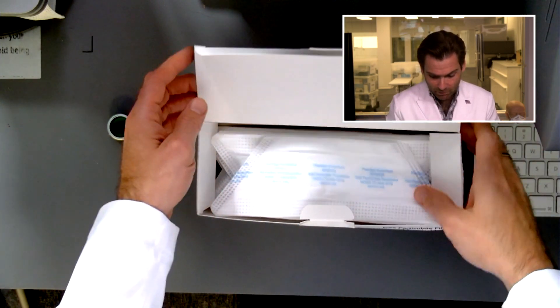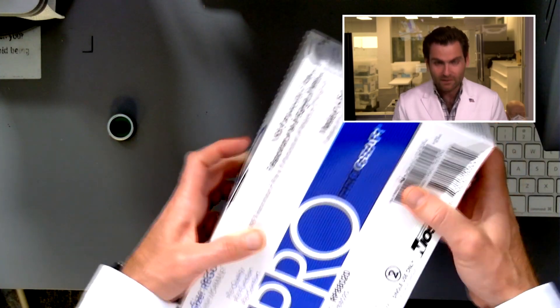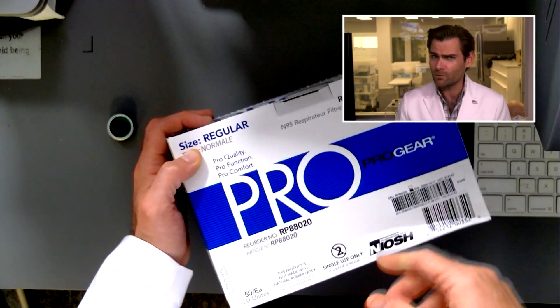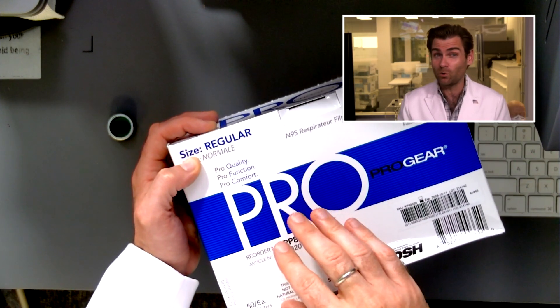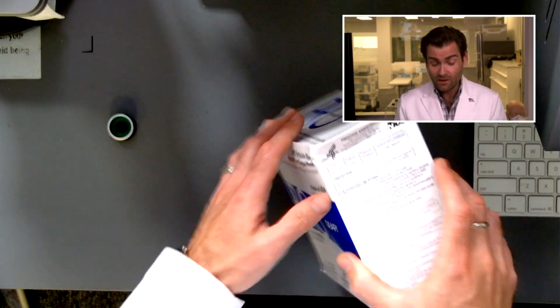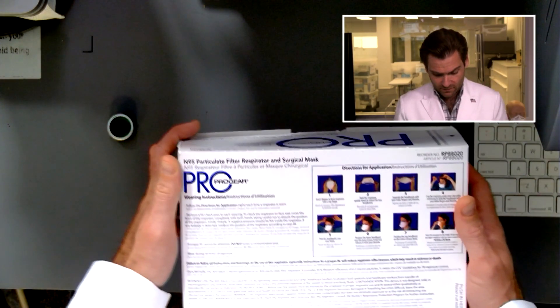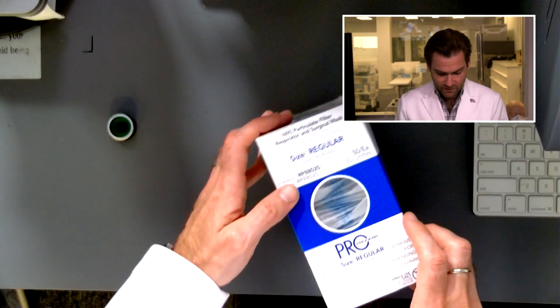I actually love the style of this type of mask in application, and I'll show you in just a second. But first, I want to show you this box — it's got a couple of cool features. It's not a soft-touch box but it does feel very professional. Prestige Ameritech is one of the oldest independent N95 manufacturers in the United States, located just outside of Dallas, Texas in about a 200,000 square foot facility.